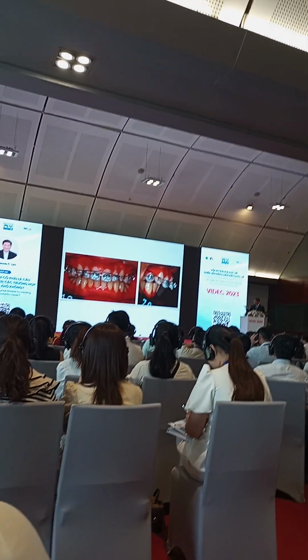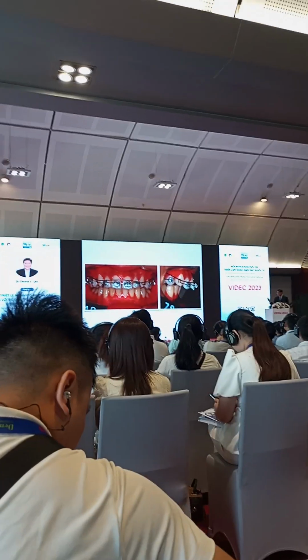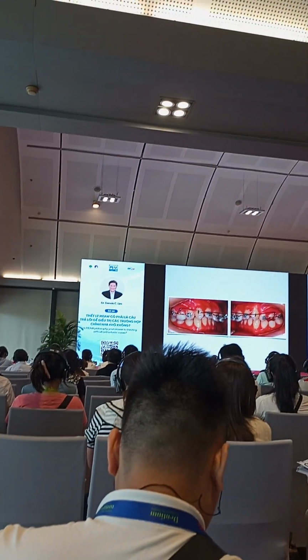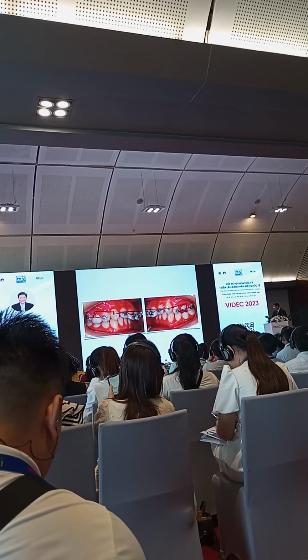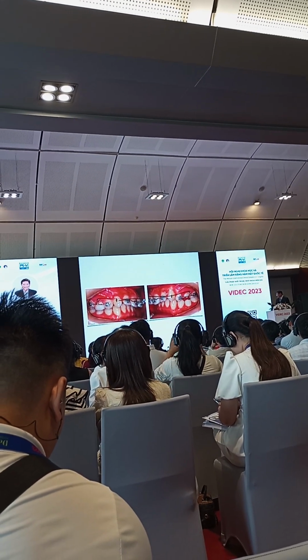From a 100% deep bite, you can see now that the bite opens. You can already see the lower teeth. If you look at the posterior area, the E is still present, that's why we have to bypass it. They just included the second premolar and the first premolar, and soldered the wire.